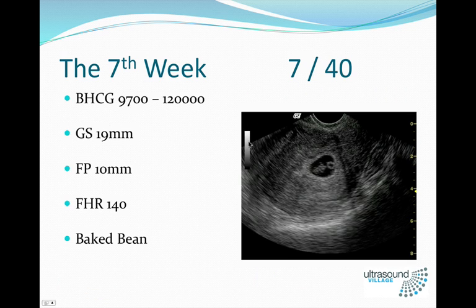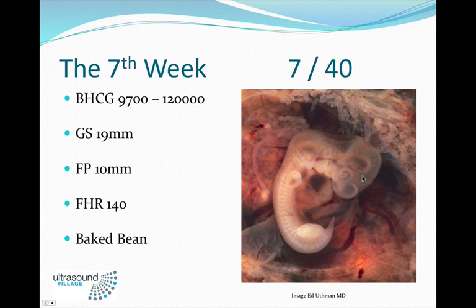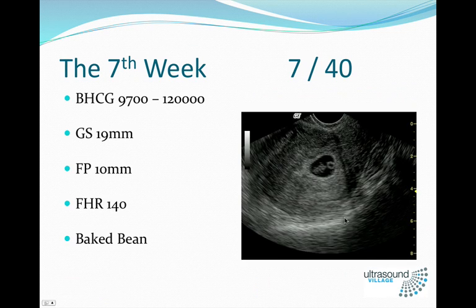Here is the ultrasound. All these ultrasounds are from my patients, but obviously the images of embryos I've taken from the internet, and thanks to the people that provide them. I've done all these pictures with different ultrasound machines, some good, some bad, deliberately, so you can get a picture for what it's like.